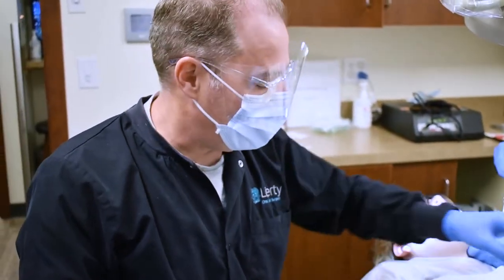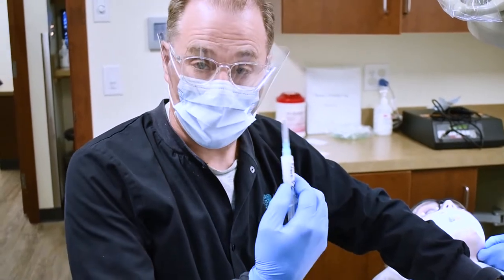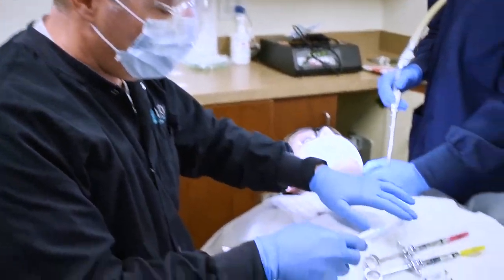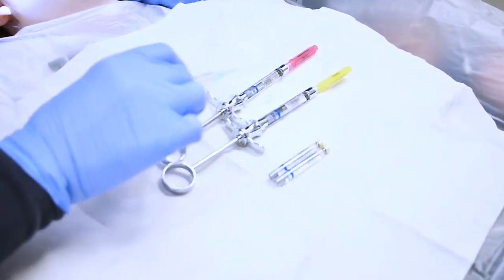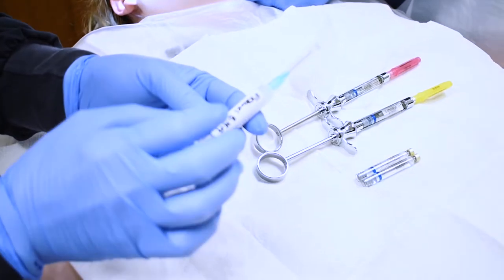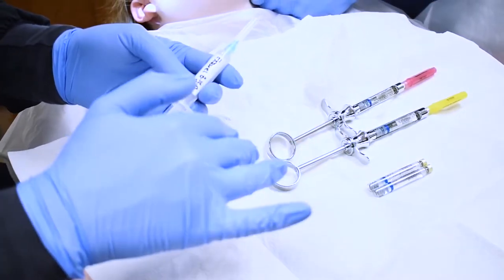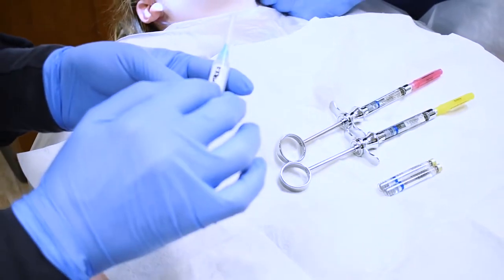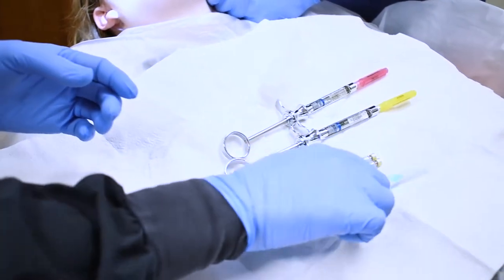Because we're using Exparel, the ultra-long-lasting local anesthetic, we have four carpules of Marcaine so I can administer the Exparel immediately. If you give a different type of local anesthetic, you have to wait 20 minutes before you can administer the Exparel, but I want to give it right off the bat.